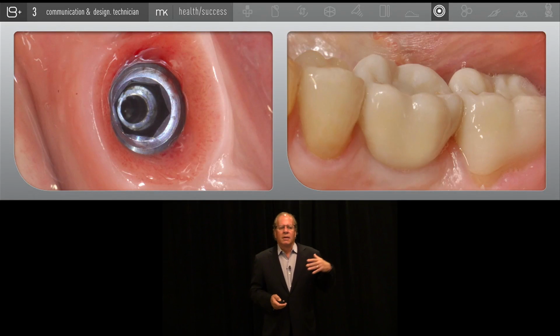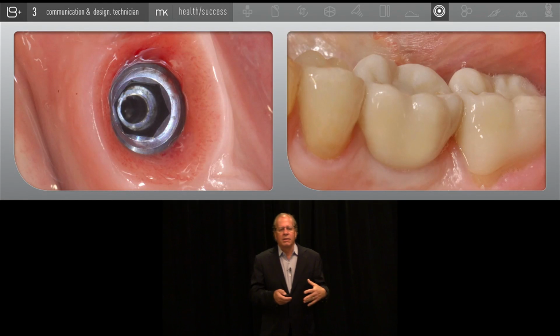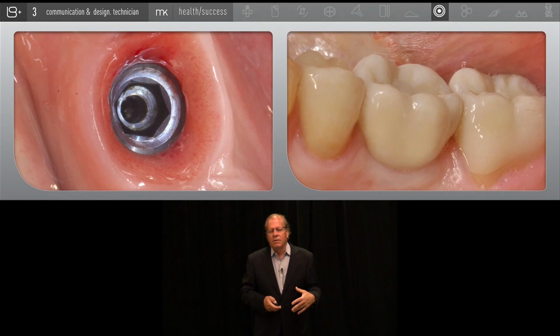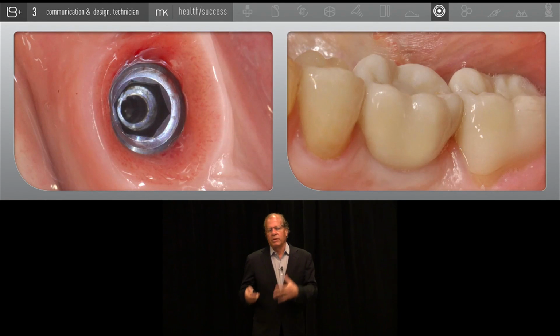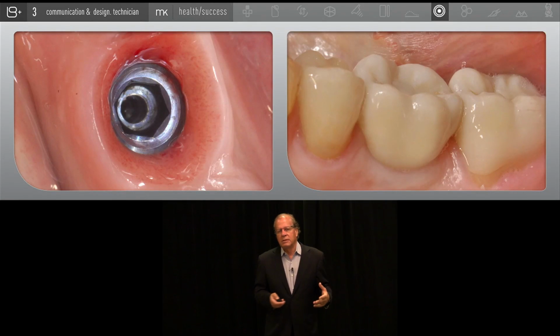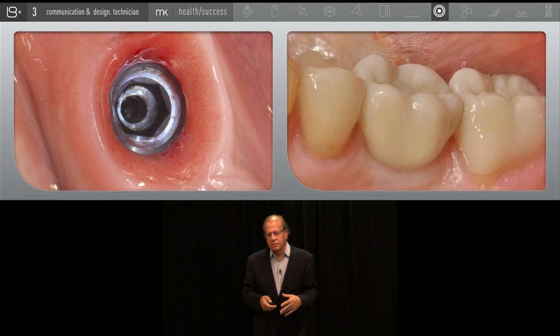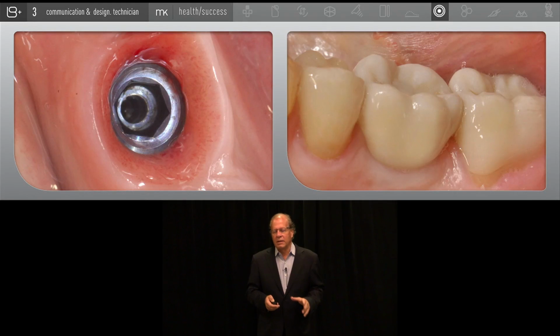In other words, we asked for the fabrication of the components, and then I went about assessing clinically whether these designs were accurate, filling the profiles correctly, supporting the soft tissues, and whether the crowns that went over these abutments, whether they were hybrid, and I'll show you that in a moment, or cemented, would co-support the soft tissue and as well have the proper interproximal contacts and occlusal contacts. So this is really interesting to me. It's kind of like a non-biased study.